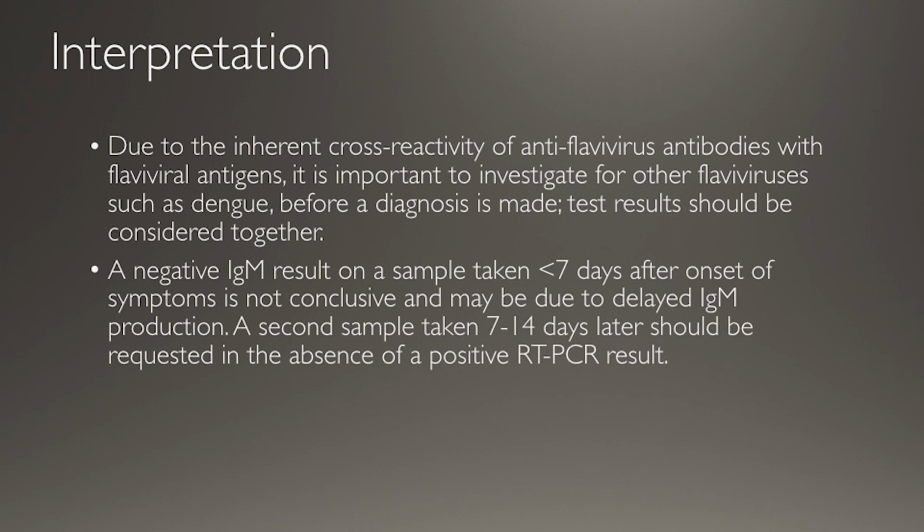Because of the inherent cross-reactivity of flavivirus antibodies with flavivirus antigens, it is important to investigate any positive results for other flaviviruses, such as dengue, using a confirmatory plaque reduction neutralization test before a diagnosis is made. And results should be considered together.